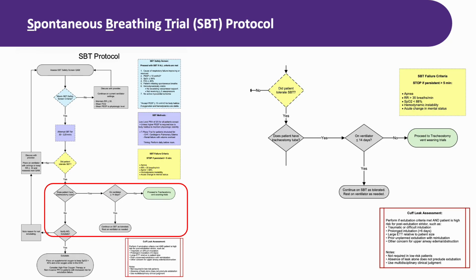The beauty of the standardized approach is that it removes inconsistency. You don't have to wonder whether you should trial today. The protocol tells you to screen every morning. You don't have to guess at what constitutes failure. The criteria are clearly defined. You don't have to figure out where to document. The workflow is built into the electronic health record. And as we transition to the next protocol section, I want you to carry this mindset forward. Screen, trial, document, communicate. That is the SBT workflow in four words. And when every RT across the system follows the same workflow, our patients benefit from consistent, evidence-based care.